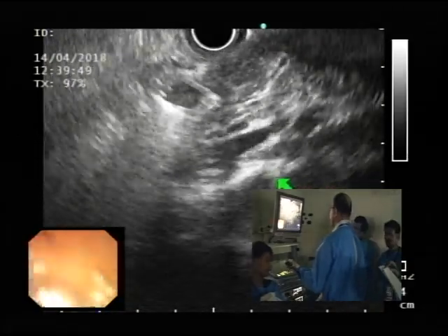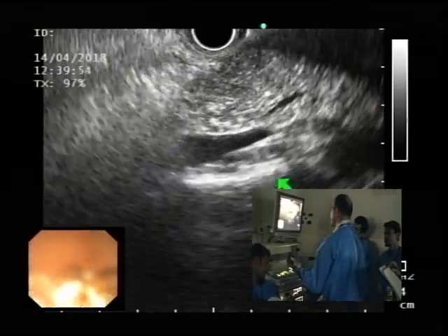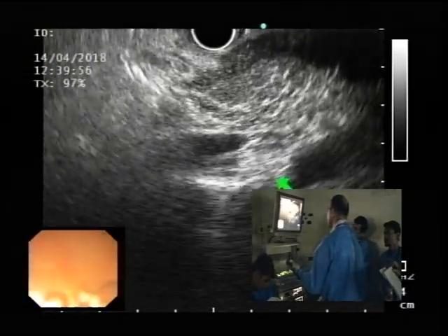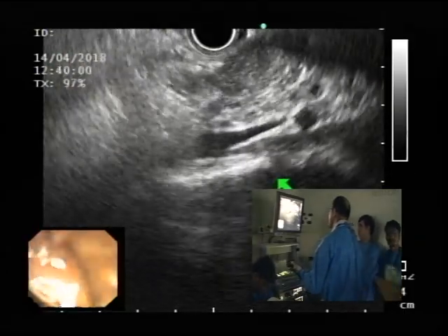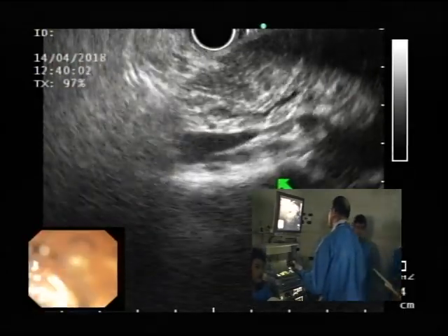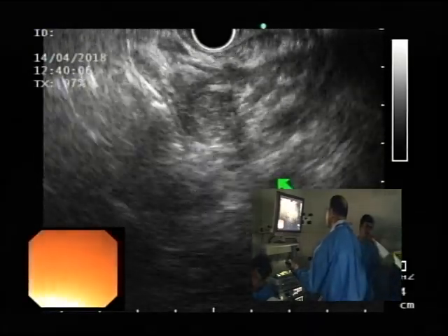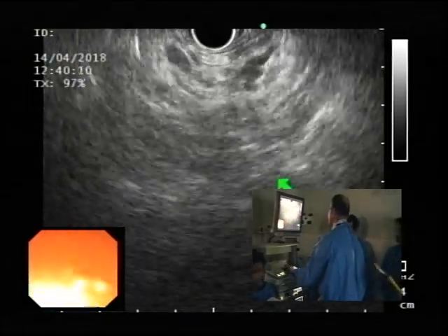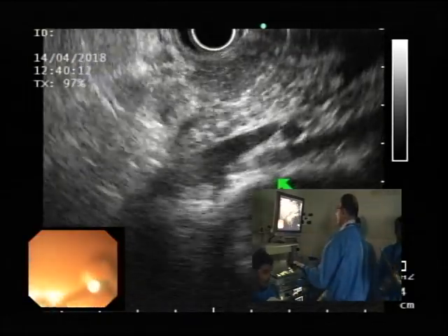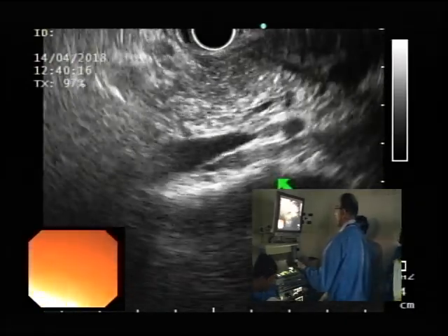I apologize for the lack of certainty on my part, which I feel is the quality of the image. But this is a pancreatic duct. I'm being told that he had a minor papillotomy. I don't know if Dr. Nyas can confirm that or not. I honestly will have to look and I'll tell you guys. I'm actually at the moment trying to figure out how to improve the thing for the next case. I've not been involved, but I can just have a look and tell you in 2 minutes.